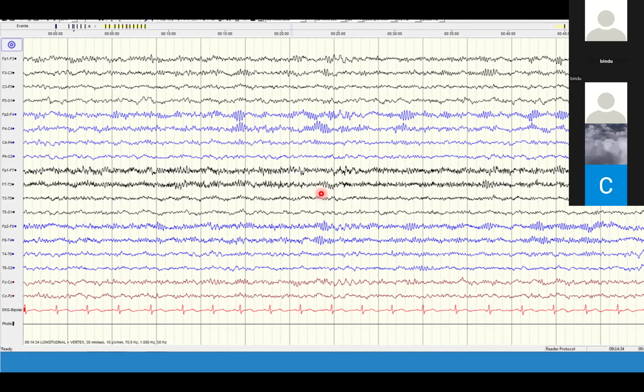This EEG will support the diagnosis of benzodiazepine use. That is the supportive role of the EEG. It doesn't replace the need to do the urine for benzodiazepine and toxins and all those things. This is not a pinpoint; you have to suspect and order the investigations.